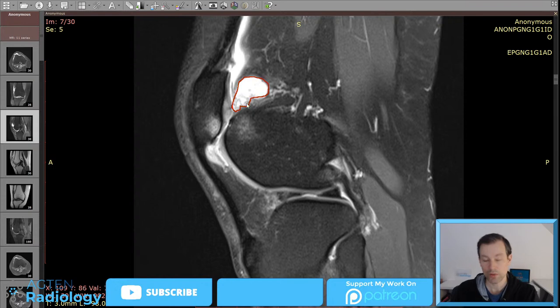There seems to be always a little bit of fat just covering it here. And this has been described, that you can get cystic lesions. They don't say in the publication, I just don't have it here now, that they are ganglion cysts. But I would still believe that it's a ganglion cyst. Technically, it could also be something like a cystic degeneration or pseudobursa that's occurring because of this chronic friction.